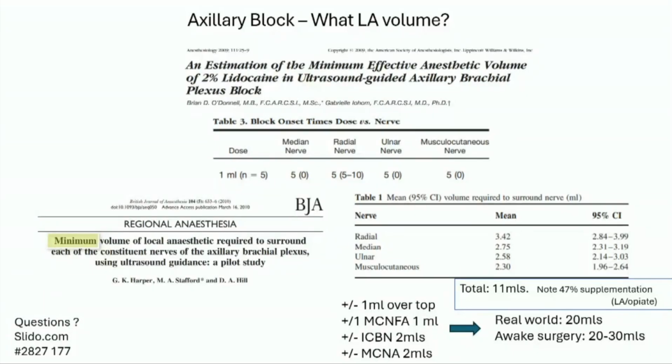Clearly, if you've got good spread around everything, then call it quits. But this needs to work, and there's no prizes at the end of it for having loads of local left in your syringe if the patient doesn't have a successful experience. So that's what I draw up, and that's going to factor into what I'm using distally.